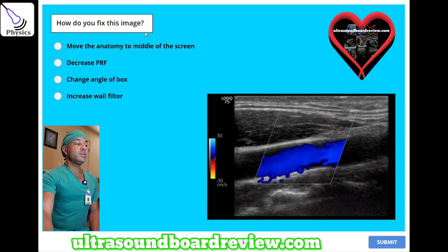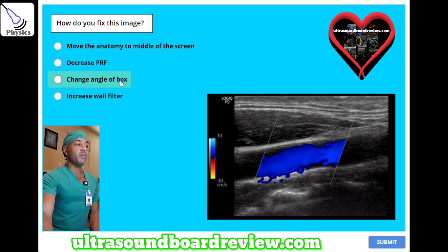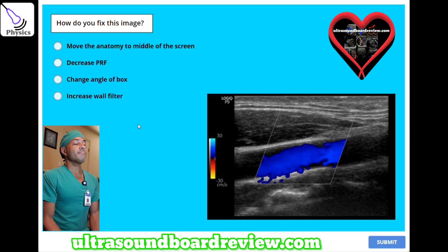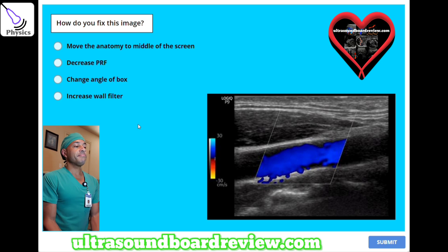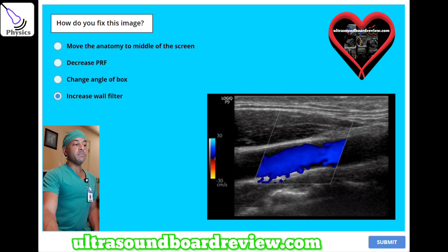How do you fix this image? A, move the anatomy to the middle of the screen. B, decrease PRF. C, change angle of box. Or D, increase wall filter. The answer is D — increase wall filter. This image shows ghosting artifacts, which is kind of like bleeding in tissue.